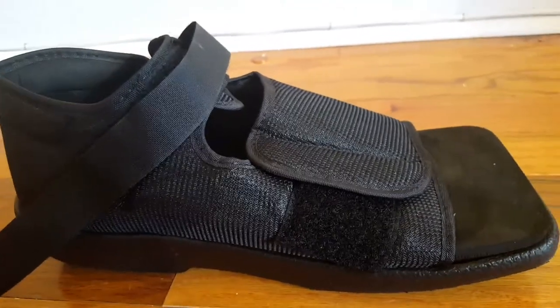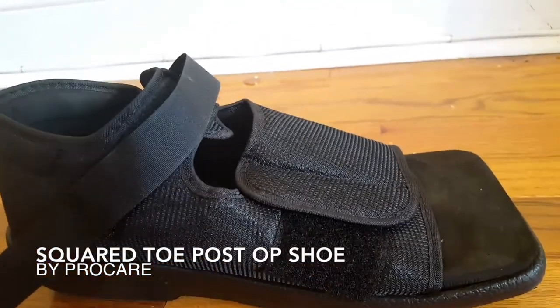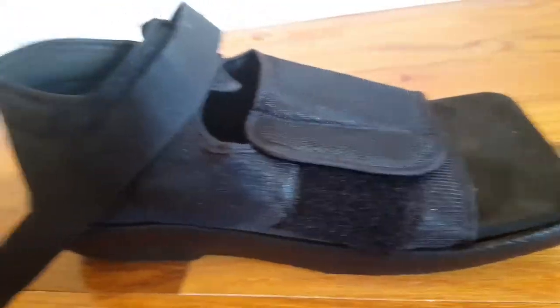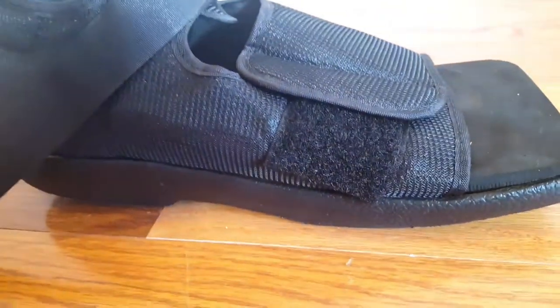Hello! Today I'm going to talk about the premium post-op toe foot fracture square toe walking shoe, and this is a women's large.